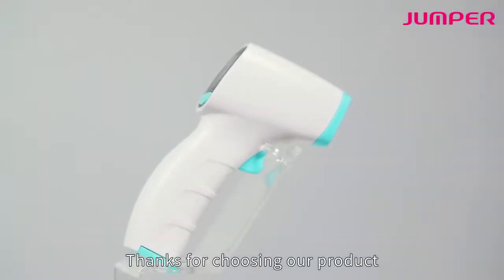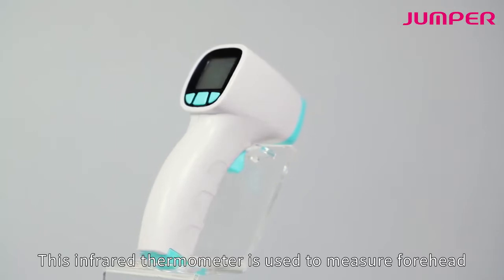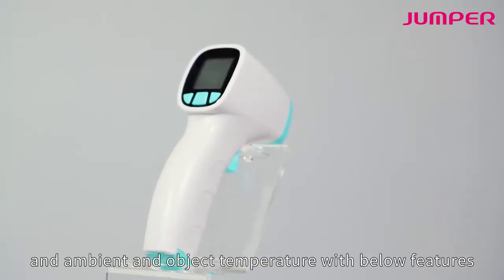Thanks for choosing our product. This infrared thermometer is used to measure forehead, ambient, and object temperature with the below features.